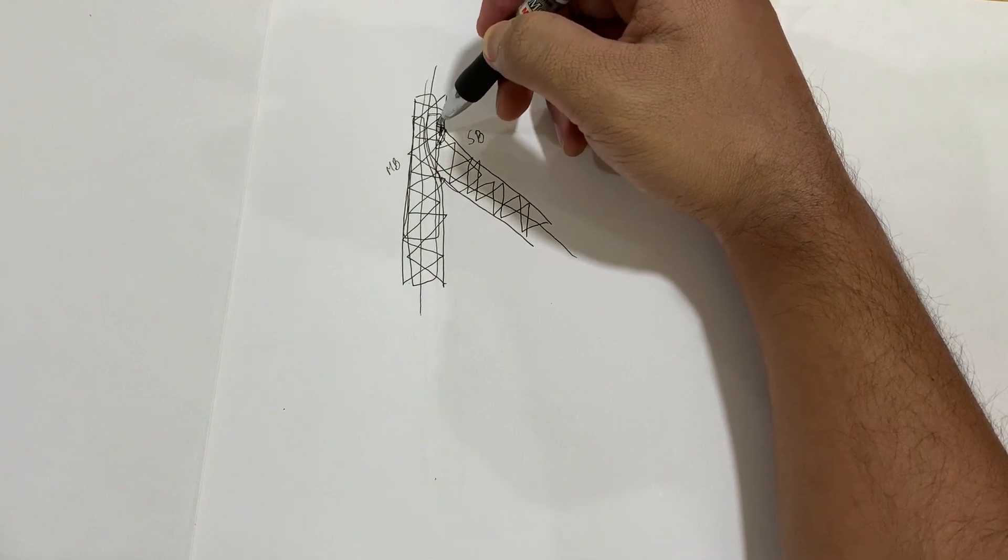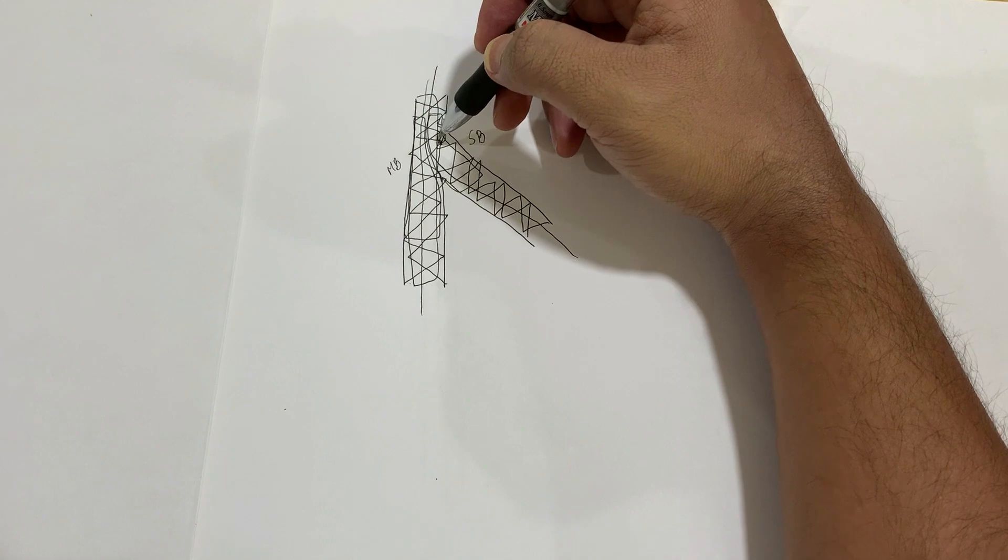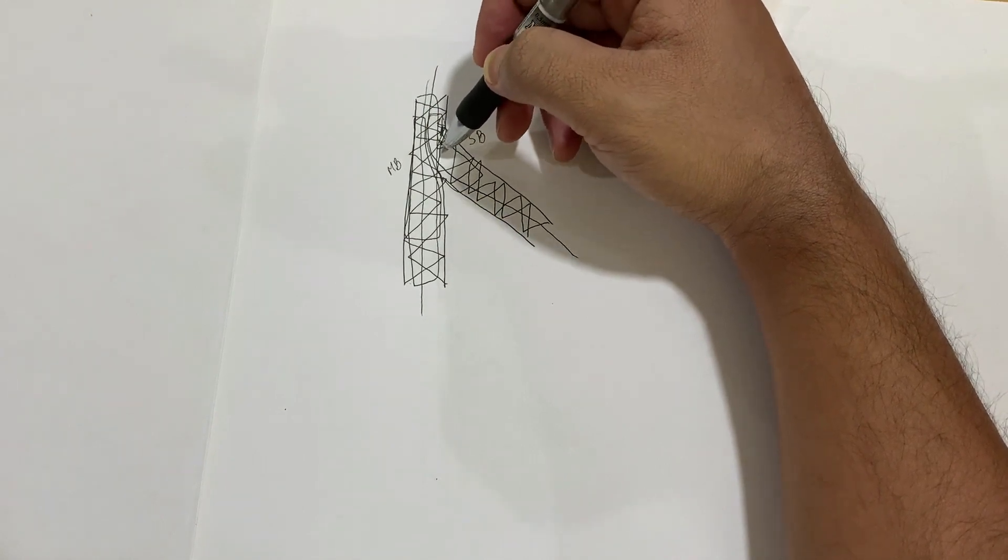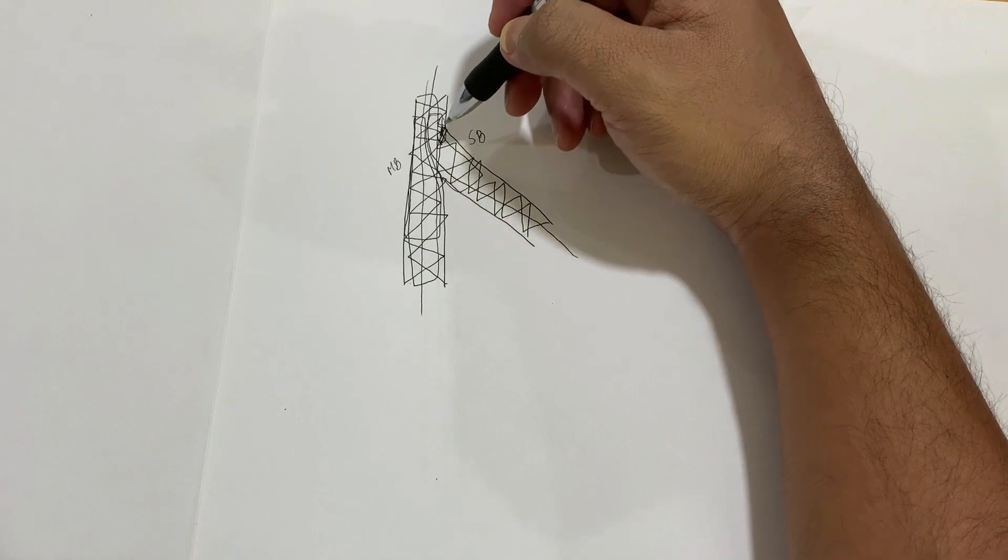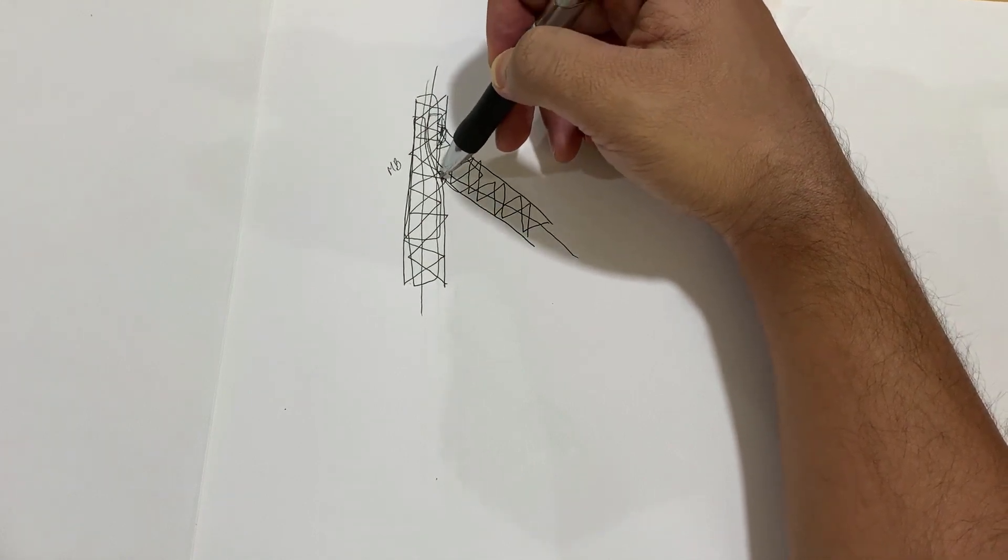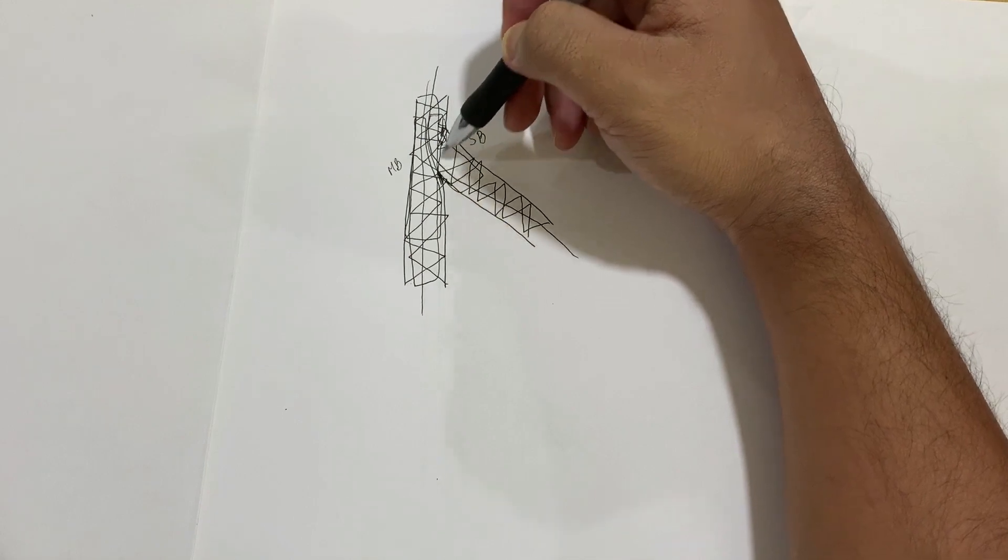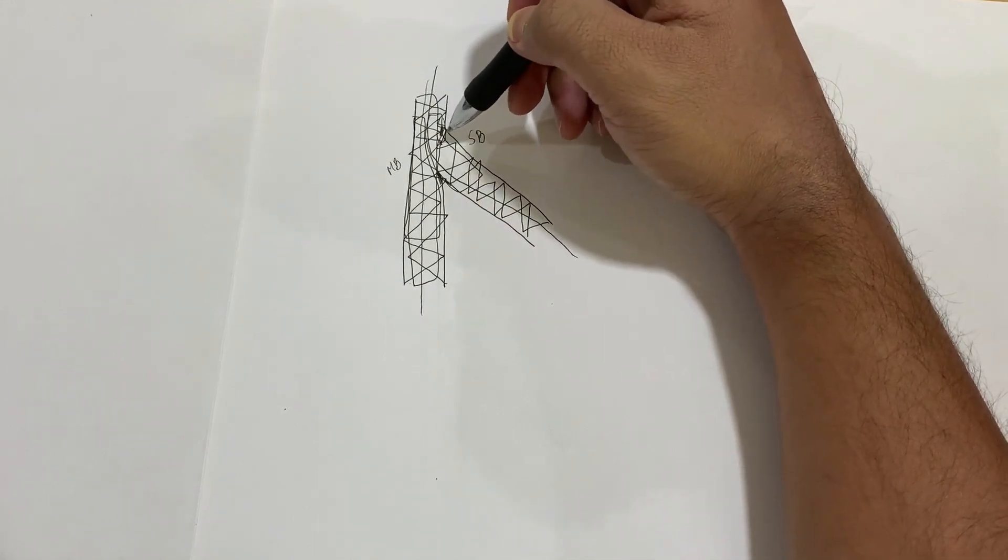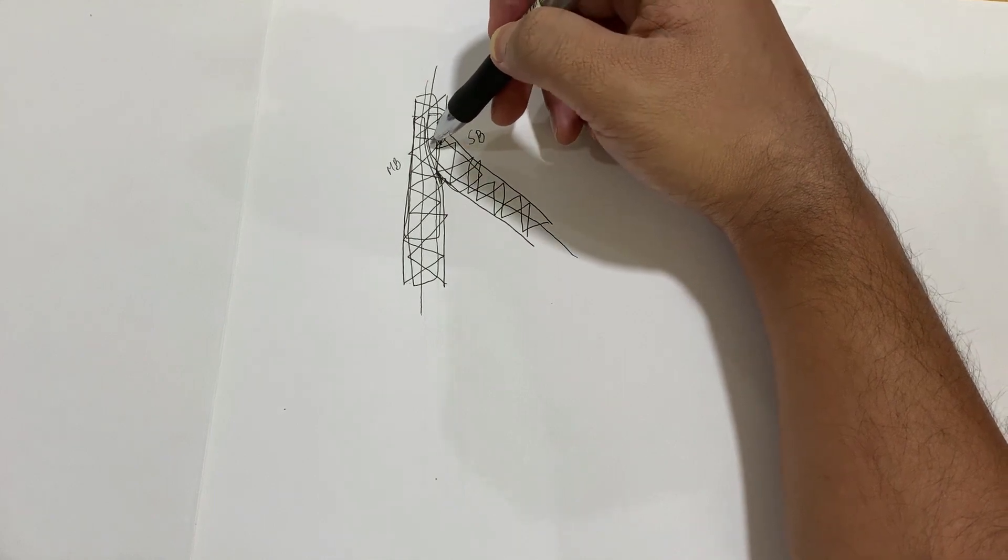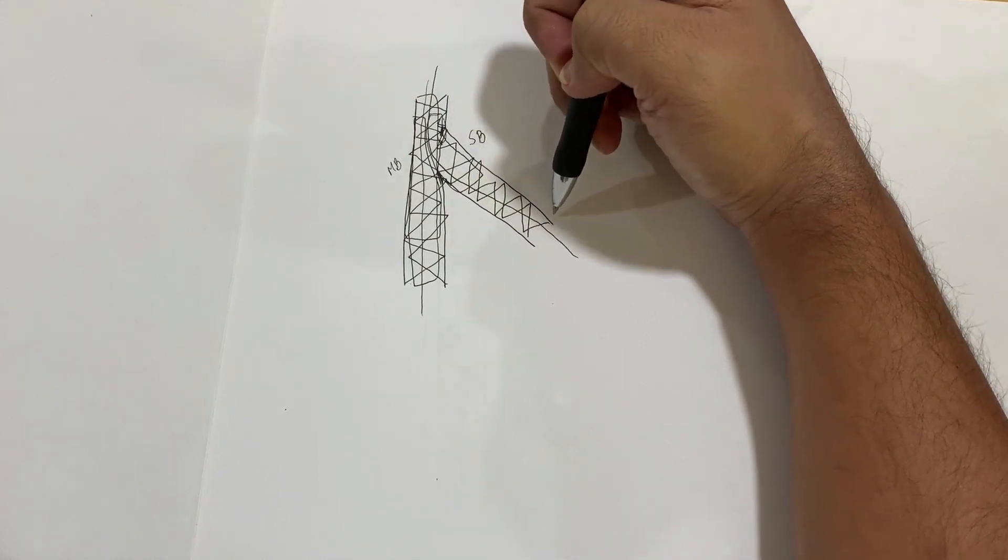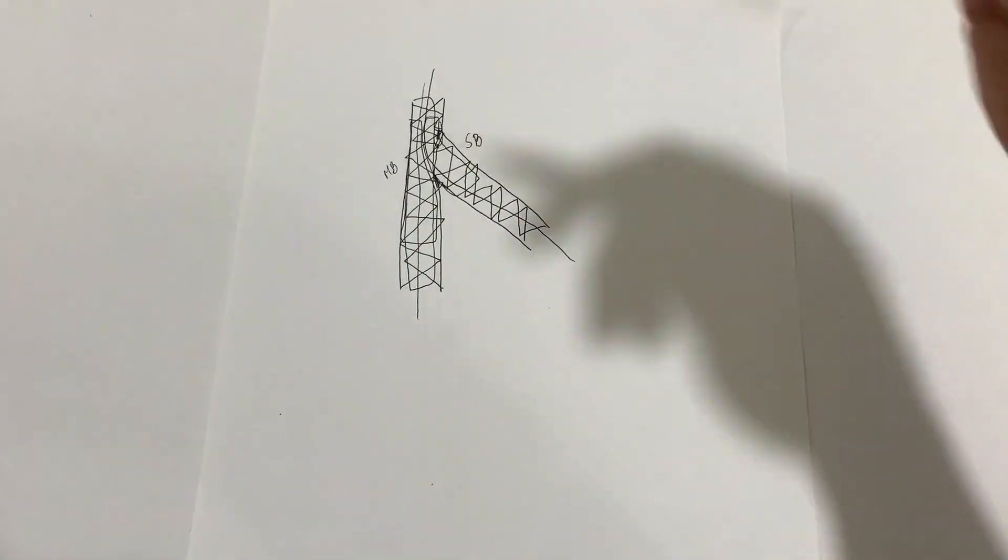In mini crush technique, it is important to look at at least in two shots prior to inflating the stent in the side branch. The reason for that is that sometimes this carina can be missed. Since in mini crush you only have one to two millimeters of stent inside the main branch, sometimes it can slide forward depending on the respiration or blood flow.